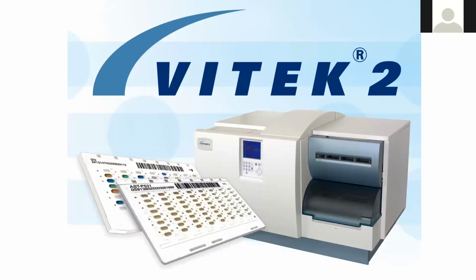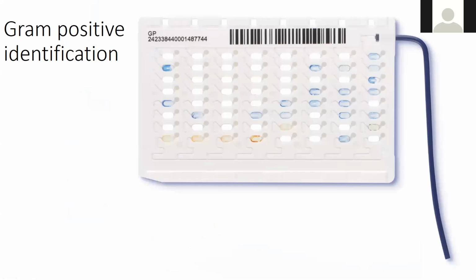So here's the Vitek. Here's the card I was telling you about. You can see the reactions the way we've been reading them. So it kind of looks like the API a little bit, but it's not a well, it is a card, a double plied card basically. So there it is. As you see, the computer has it programmed where it waits on the color change to happen. Once it gets enough info, it IDs it.